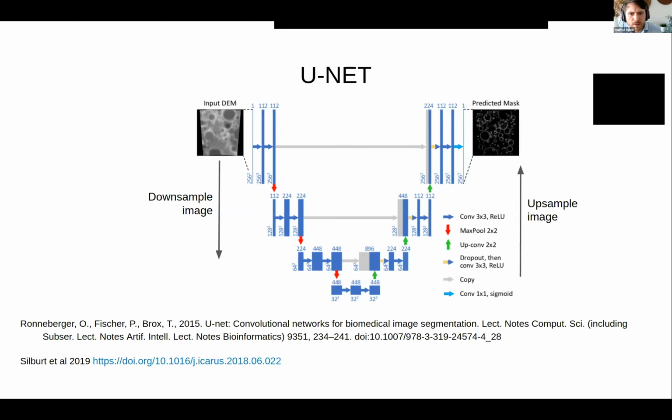And so finally, the convolutional neural network that we're going to be playing around with in just a second is called a UNet. You may be familiar with this or not, but it's a very widely used and very successful segmentation convolutional neural network.